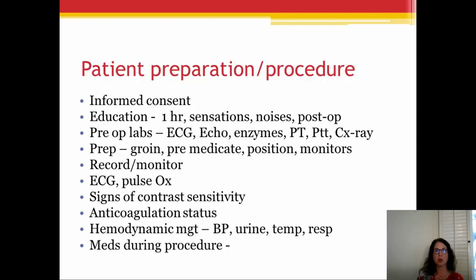Anticoagulation status, because we'll kind of anticoagulate them during the procedures a lot of the time, so we want to know if they're stable coming in the first place. And certainly hemodynamics during the procedure. What's their blood pressure? Did they void before they went in? What's their temperature? It's cold in there. Are we keeping them comfortable?